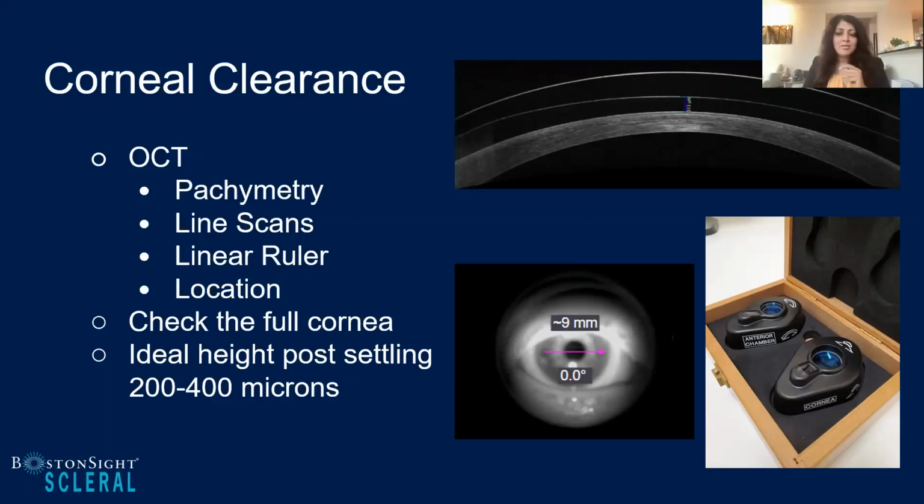And last thing to ask you, Avani, what is your ideal height that you're looking for once the lens has settled, whether that's 1 hour or the 4-hour mark? What are you aiming for?